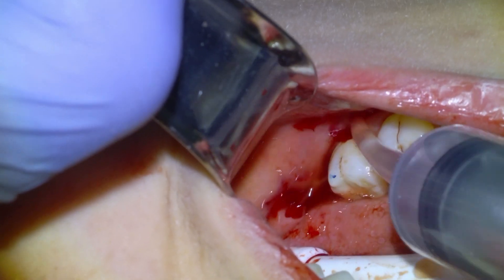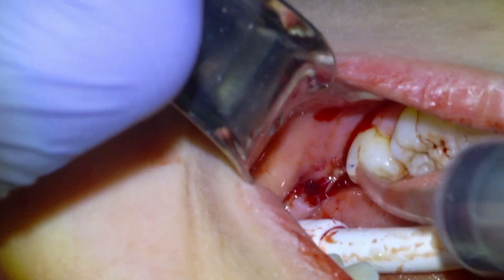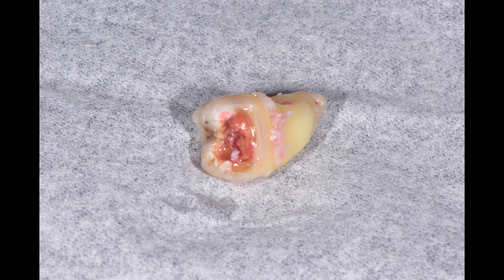And that's that procedure. We'll put some gauze in and send the patient home. There's the wisdom tooth — you can see the big cavity in it.